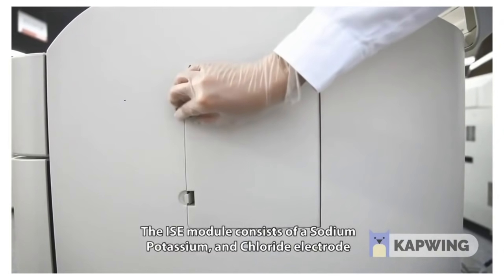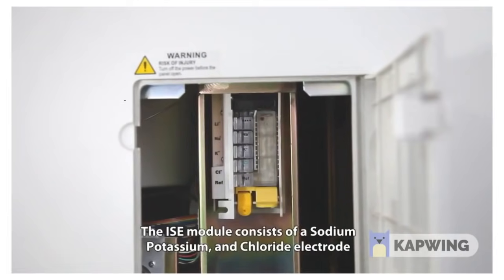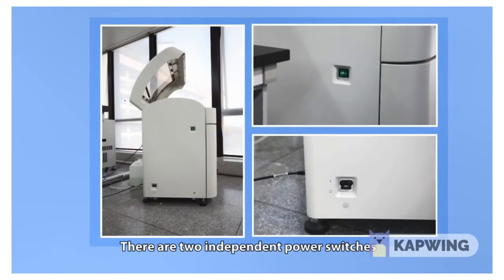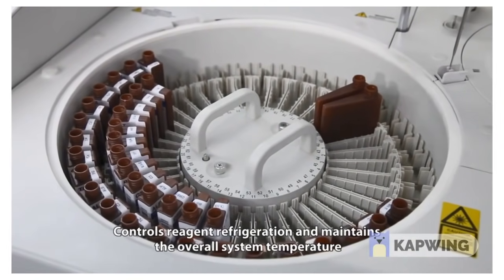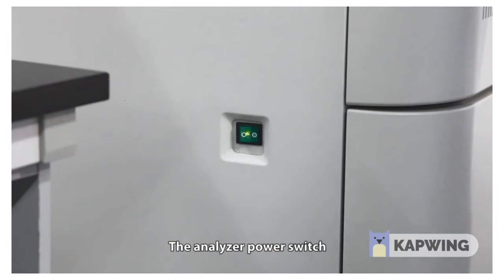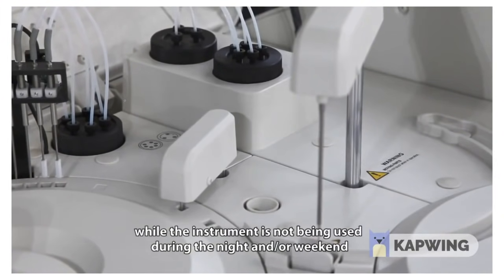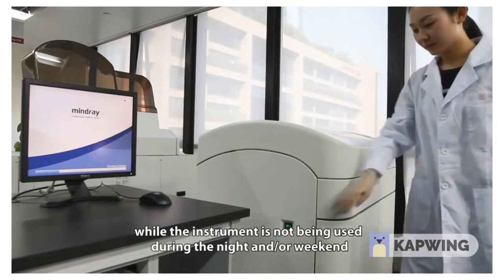The ISE module consists of a sodium, potassium, and chloride electrode and is located on the side panel for easy access. There are 2 independent power switches. The main power switch controls reagent refrigeration and maintains the overall system temperature. The analyzer power switch controls the mechanical parts, provides energy savings, and prolongs lamp life while the instrument is not being used during the night and/or weekend.